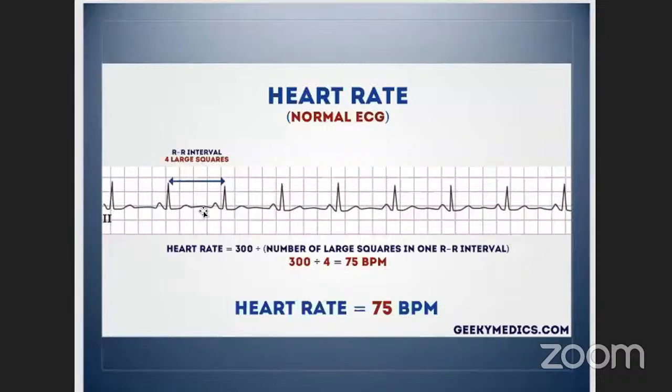If our beat is irregular, however, this is not a reliable means at all. So we would look at the bottom of our ECG, at our standard lead 2, and count the number of QRS complexes or ventricular beats in that segment. We know that is a 10-second strip, so we multiply that by 6 to get 60 seconds, and that also gives us our rate. The method on the slide is the easiest and quickest, but not applicable when there is an irregular or regularly irregular heartbeat.